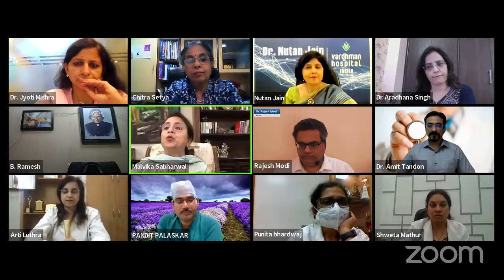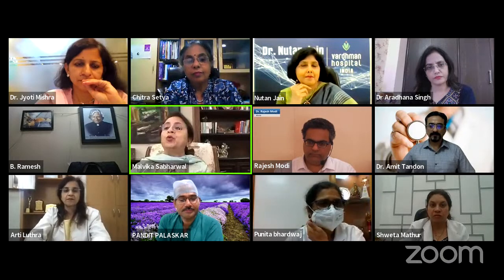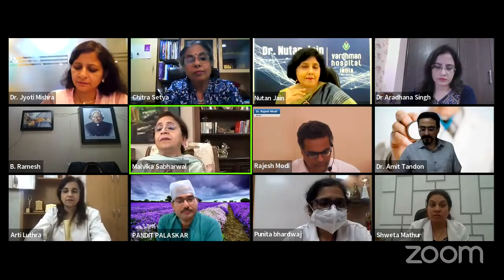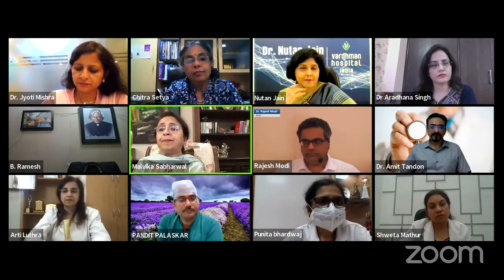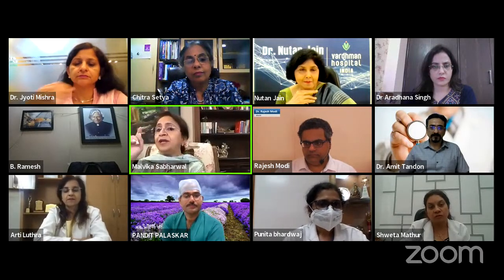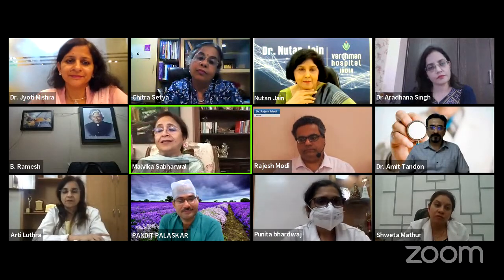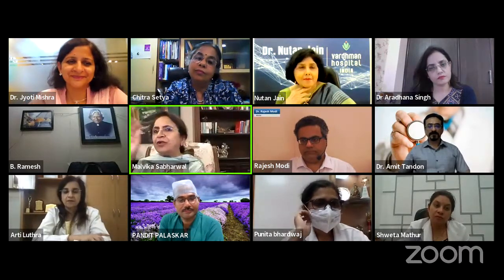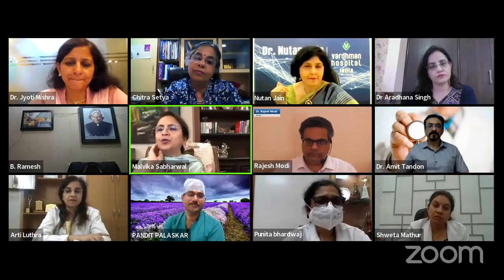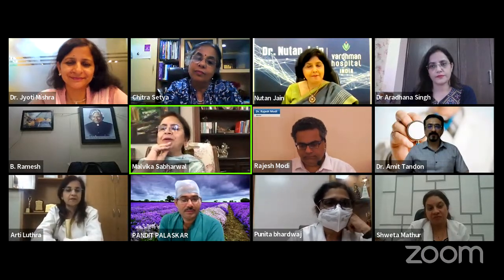So what you have shown is excellent, with good take-home messages. I especially appreciate the cases you showed going high up, wherein the fundus is getting involved. Because I remember having initial cases, like you said, 18 years back, where you start to do adhesiolysis and a small nick is made, and you know immediately that you've entered the bladder. So no problem. You have to do endosuturing and proceed, like you mentioned beautifully.